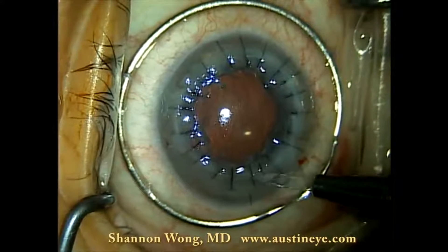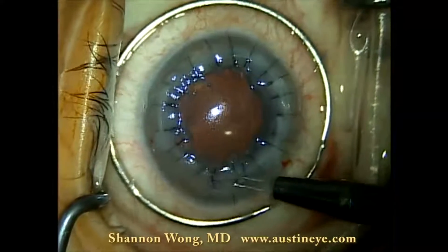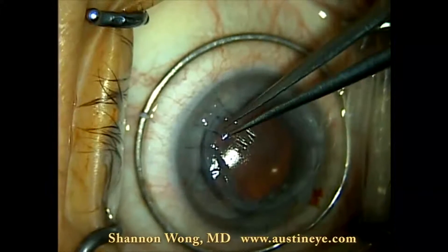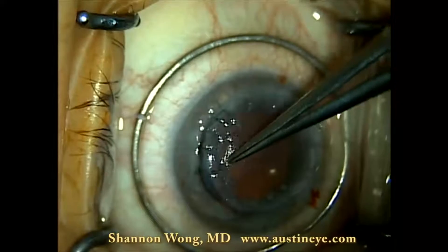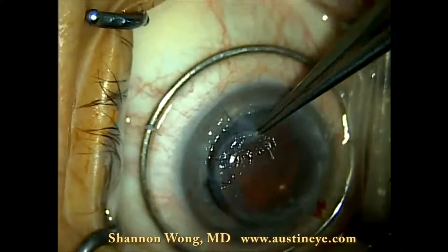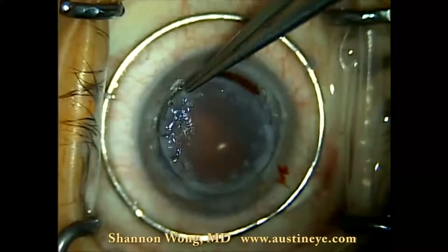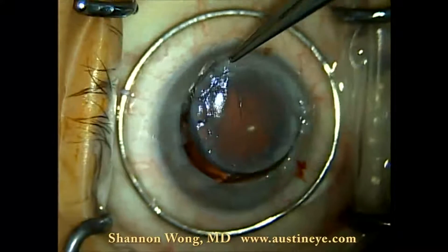We decided to try to remove the cataract while the original donor cornea was healing. That cataract surgery was complicated due to the inability to clearly visualize the intraocular structures. The cataract was removed safely, but the capsular bag opened and the lens was malpositioned into the eye.